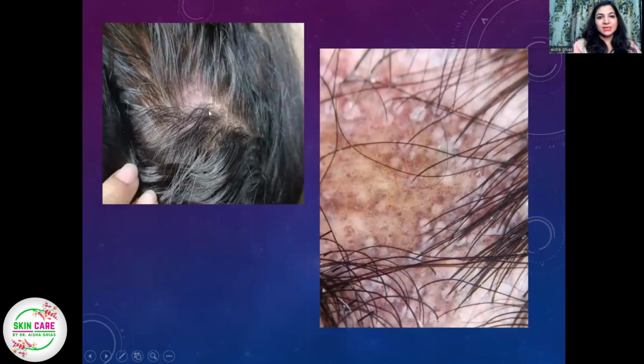All right, case number 7. You see these hair follicles. There is enlargement of the hair follicles, and then there is obviously pigmentation around. On the skin, can you see the blood vessels? I can see some erythema over here, but no particular blood vessels.